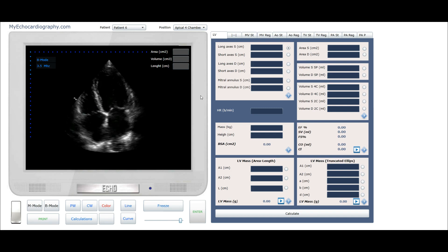Start the measurement from the apex and end the measurement at the midpoint of the left mitral annulus. Click the button Enter to save the value.